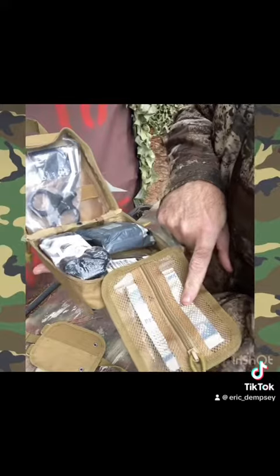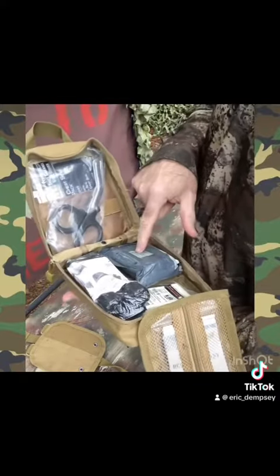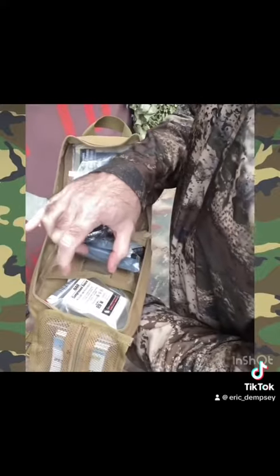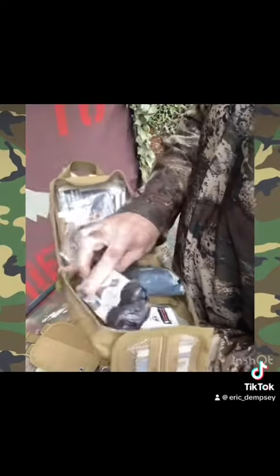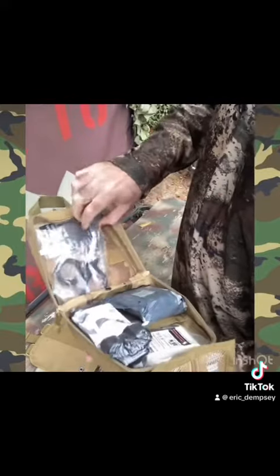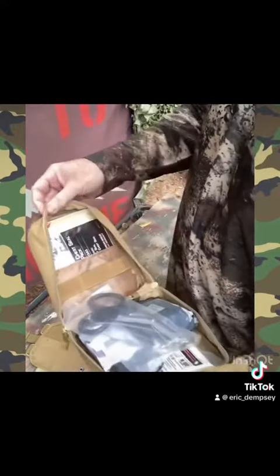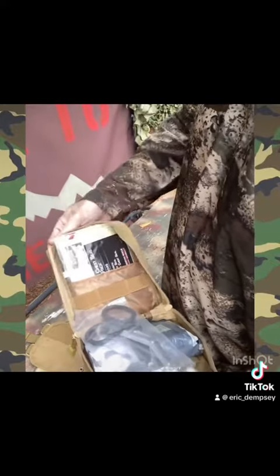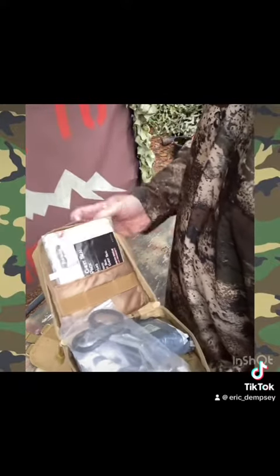This one's got an emergency blanket, four-inch Israeli pressure dressing, compressed gauze, CAT tourniquet, EMT shears, and two chest seals — one vented and one not vented. It's Marine Corps issue.